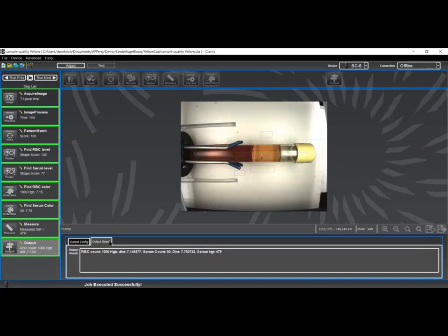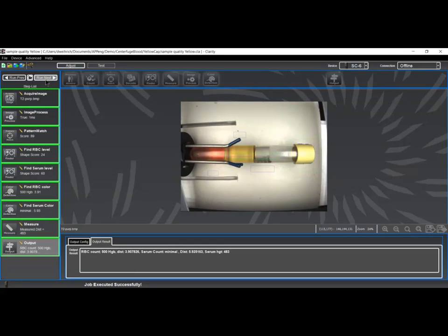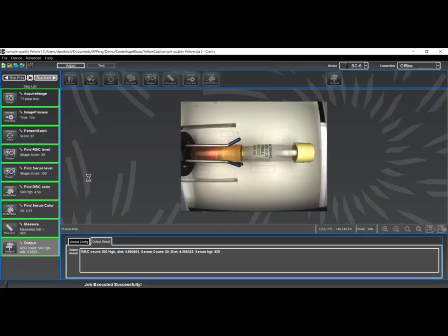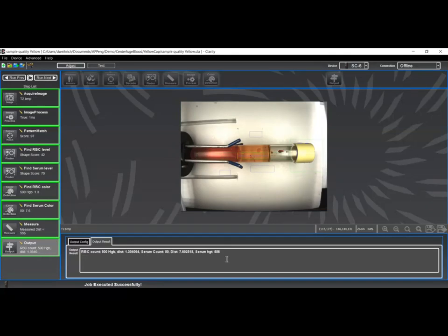Now what it looks like coming out of the machine vision platform is basically a text string that's shown here. For every one of our samples, these text string values will change. So you can see the distance values and the color name, which is associated with the reference color, are all basically output as a simple text string.